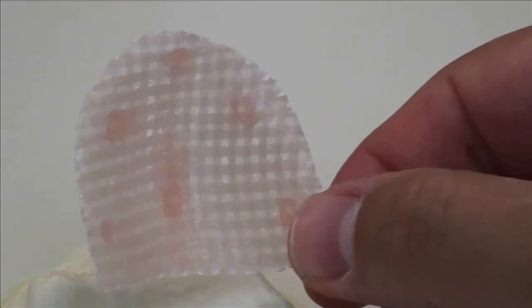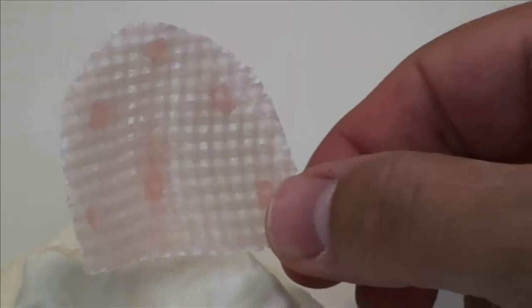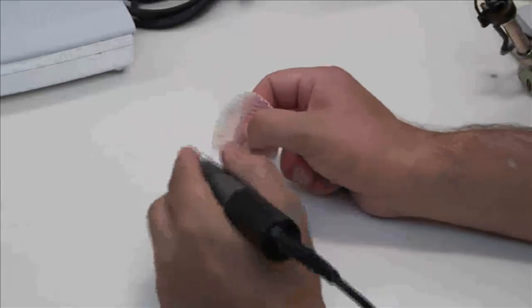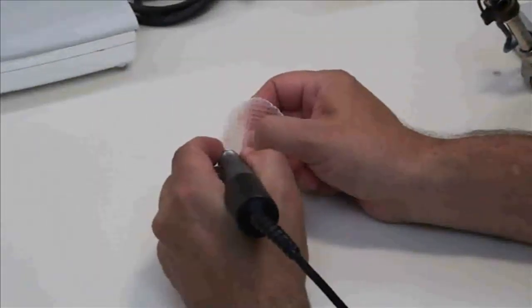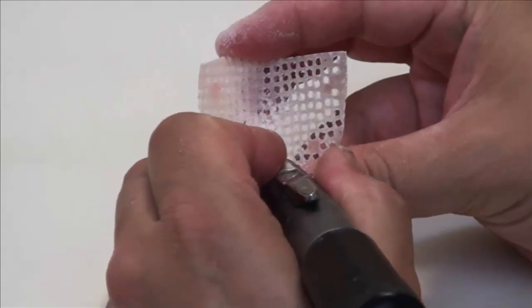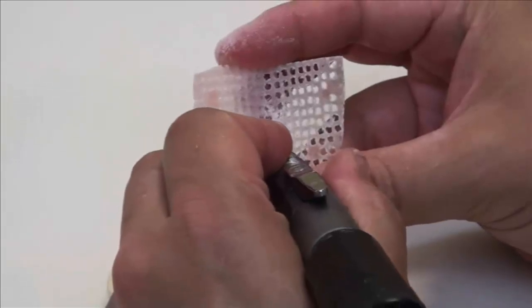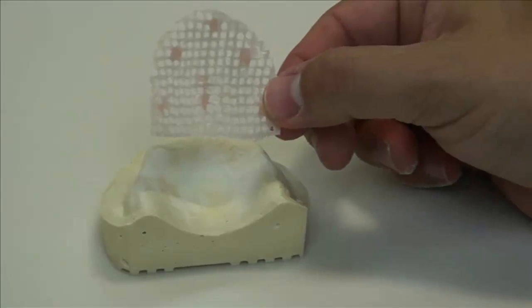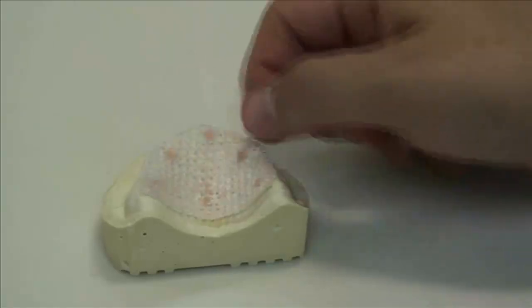The final step in the process is unblocking the thin resin flash that fills the spaces in between the fibers. This will allow the acrylic to flow through the framework when the denture is processed. Be sure to avoid damaging the fibers when opening the spaces. The framework is now ready to be processed into the denture using your usual technique.